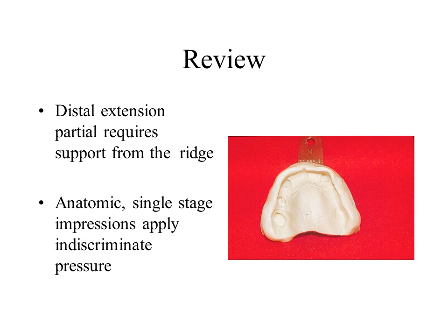Review the rationale and criteria to employ the altered cast impression.